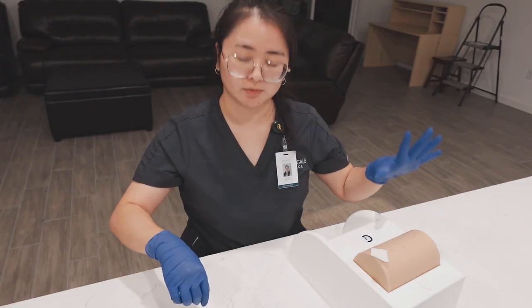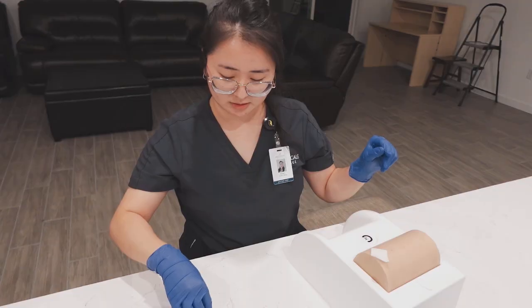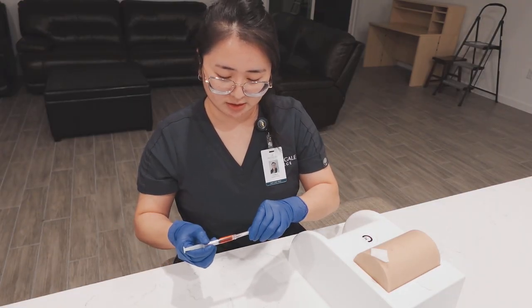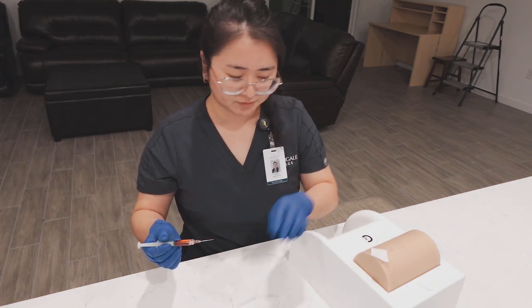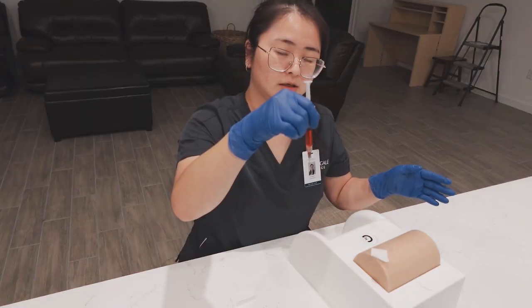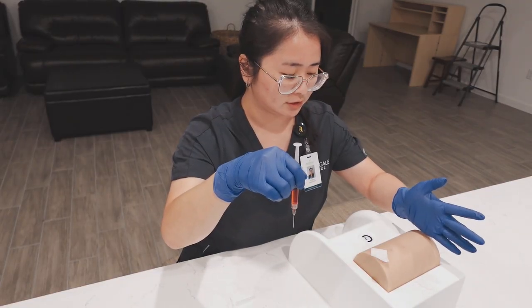Now this alcohol pad is just supposed to mark where the injection site is, and so we want to make sure that dries. We don't want to fan it. We also don't want to blow it. We're going to pretend that it's had enough time to dry. Now I'm going to uncap this. We are supposed to hold it like a dart, and then we are supposed to hold it 90 degrees, or like a palm down. It's a 90-degree injection.